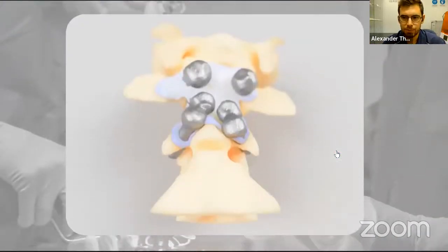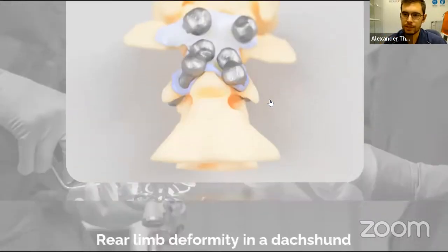And this is the post-op CT that we did and segmented. So this is the actual placement of the pins that we had on this patient. And she also recovered. She was an 8-month-old dog, so she had puppy-like behavior just a short time after.